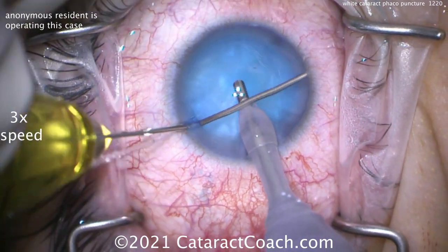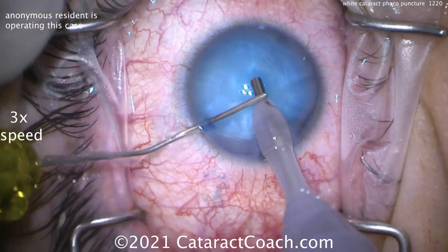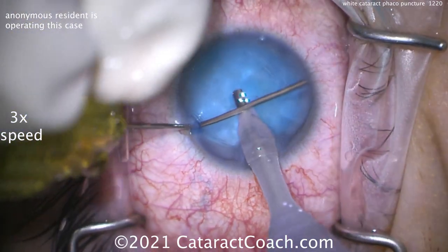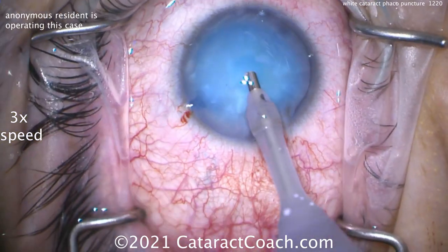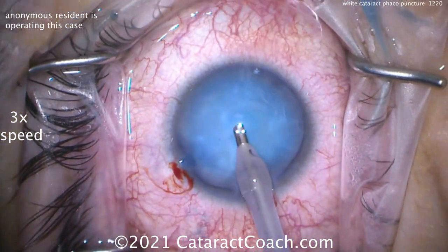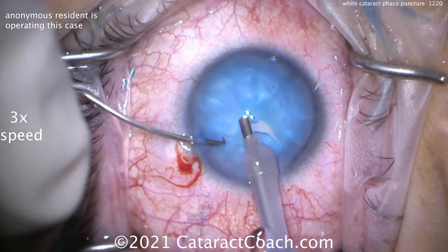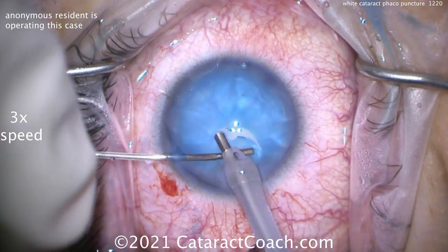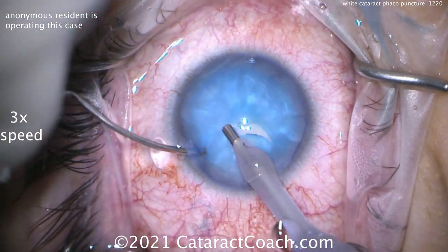I'm just lifting up the iris here to give the patient a reverse pupillary block release. This patient is also a little bit myopic. We want to avoid any issues there, so we'll tent that iris up — that helps with the reverse pupillary block. Aiming the probe right in the center of the nucleus, bevel down, barely buzz, and there it goes. Now keep the probe in the eye — so important — because you want that high infusion.